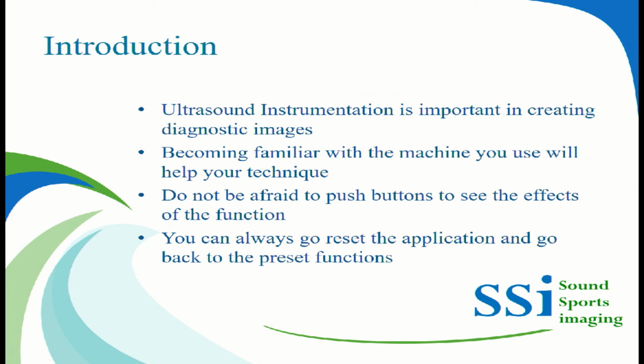As technology has improved, so has ultrasound. However, understanding your instrumentation is important in creating diagnostic images. You should become familiar with the machine you use to help your technique. Do not be afraid to push buttons to see the effects of the function. You can always reset the application.